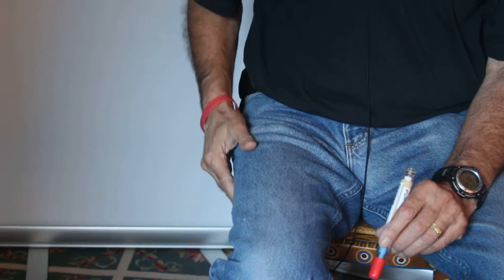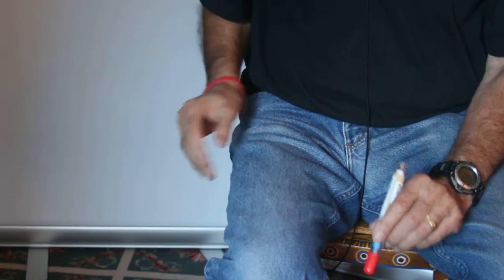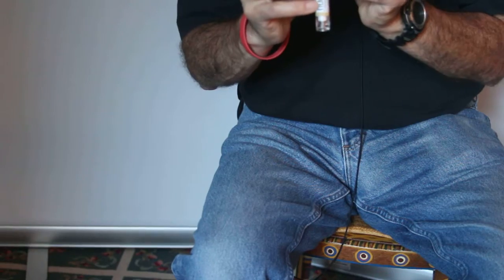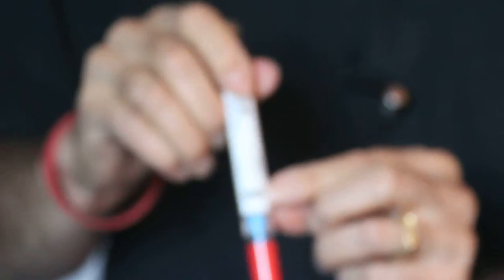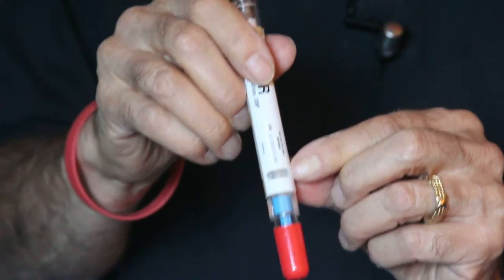5, 6, 7, 8, 9, 10. The auto-injector may show that it still has medication in it. If you look at this and you see that it still has medication, don't worry — the auto-injector knows exactly how much medication to give.